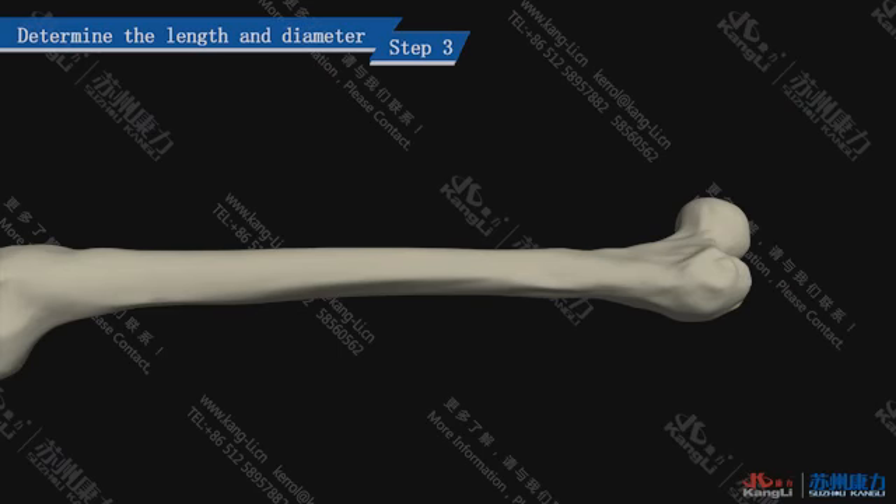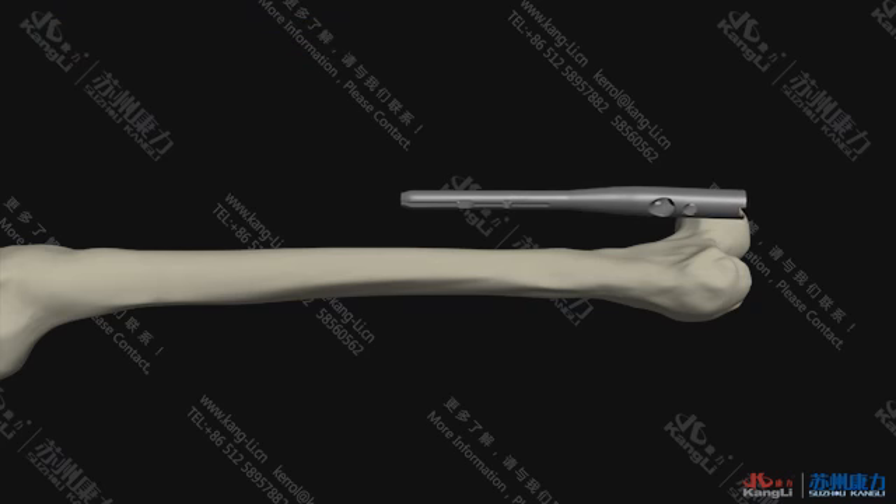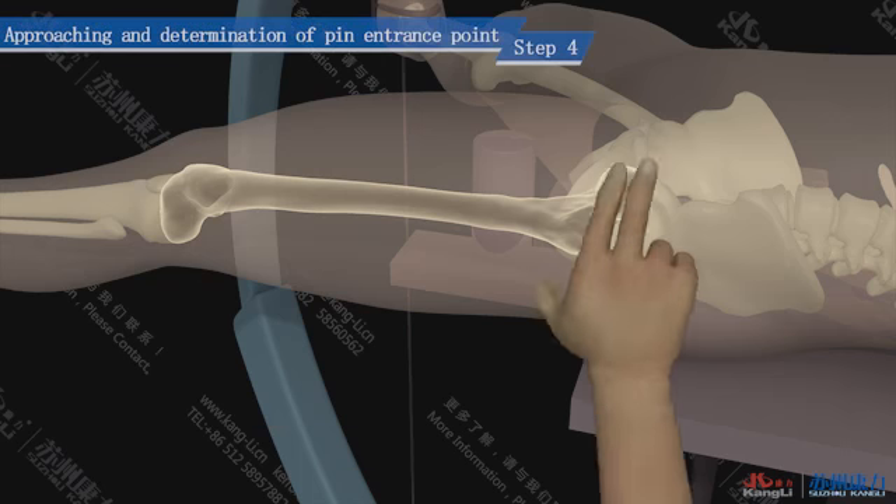Step 3: Determine the length and diameter of the nail. Place a PF pin in front of the femur, with the proximal side at the pin entrance point and the distal side at the expected position, then predict the length. The diameter of the selected pin should be 1.0 to 1.5 mm smaller than the reamer diameter.